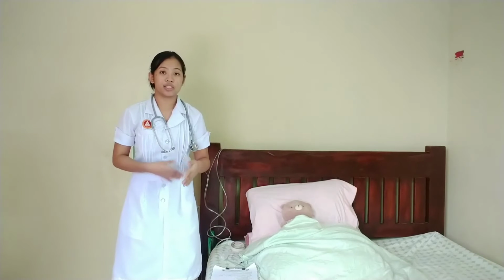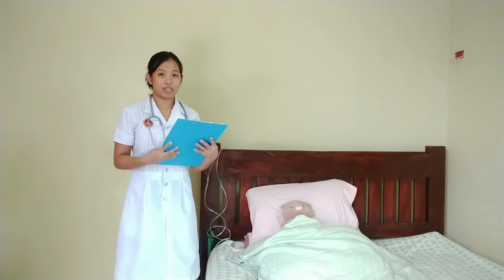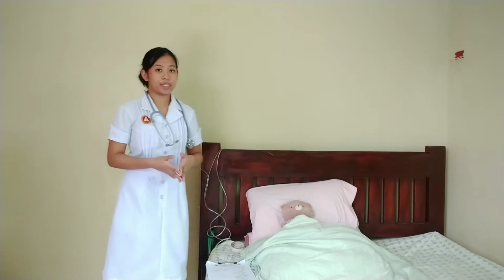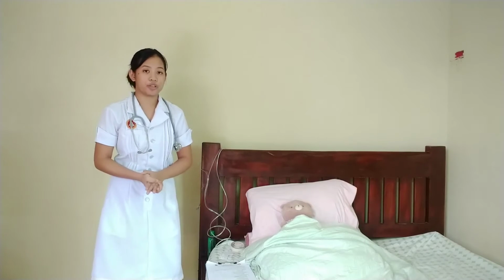So I will be checking the need for the oxygen therapy, and I will also verify the doctor's order for the need of the therapy. So let me just double check it. So it states here that the doctor ordered to administer oxygen by nasal cannula for my client. And then after that, I will be assisting my client to a semi-Fowler's position if possible.